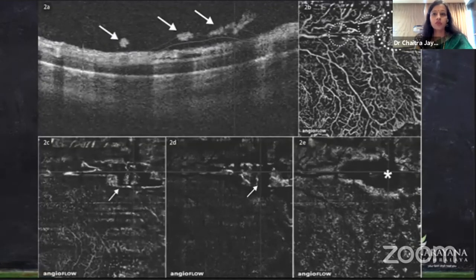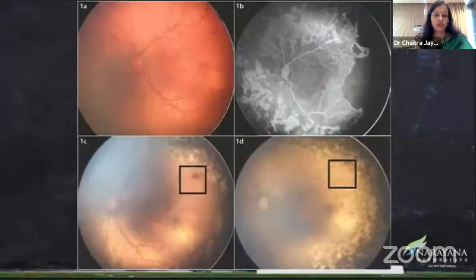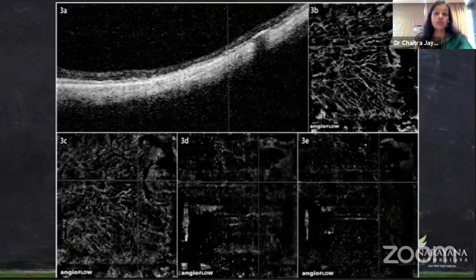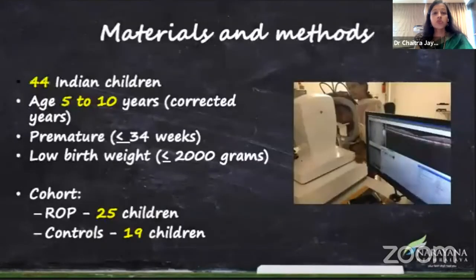But if you go on to the OCTA, you will see the NV is in the superficial layer, and the deep layer shows shadows indicating flow. And the outer layer shows the flow, and the choroidal layer or the choriocapillaris shows the shadow aspect. So selective laser was done here, and post laser, you can see that the neovascularization is now regressing, and also it has gone into the deeper layers, and that was also now returning back to normal. So it is not only superficial. What we try to show here is that the neovascularization is actually a complex which can go into the deeper layers.